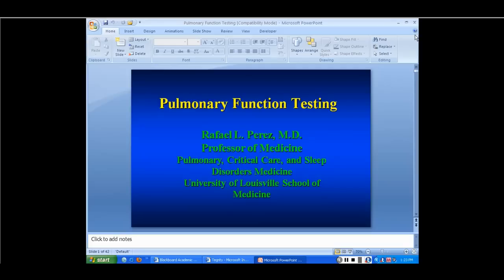Right. So sure. So in adults, the FEF 25 to 75 does look at mid flows. The problem with that is that it's very sensitive to the initial conditions. I mean, because remember, you've got your spirogram and you're going to 25% volume and 75 and you're drawing a line through that. So if you just change your technique just the tiniest bit, the slope of that line changes dramatically.